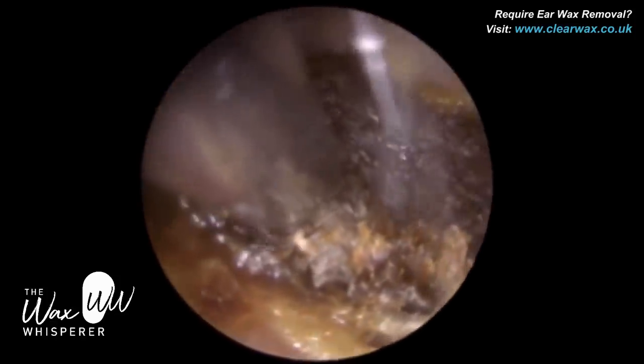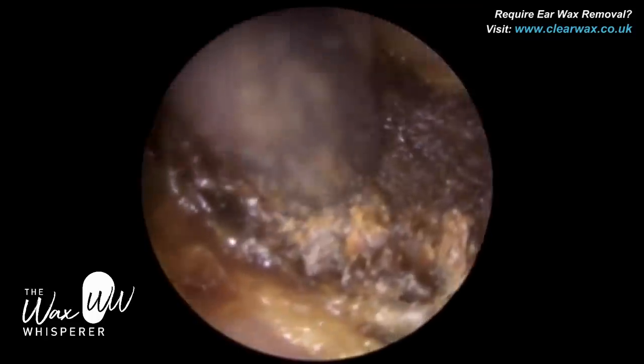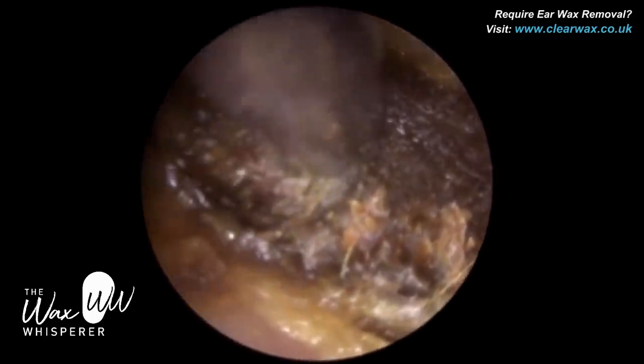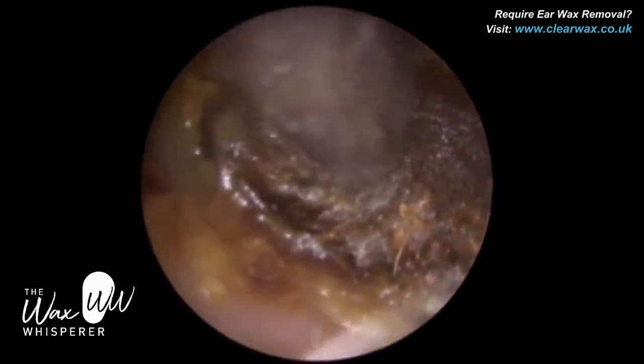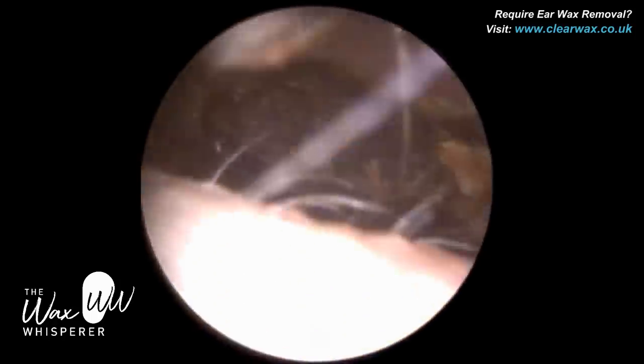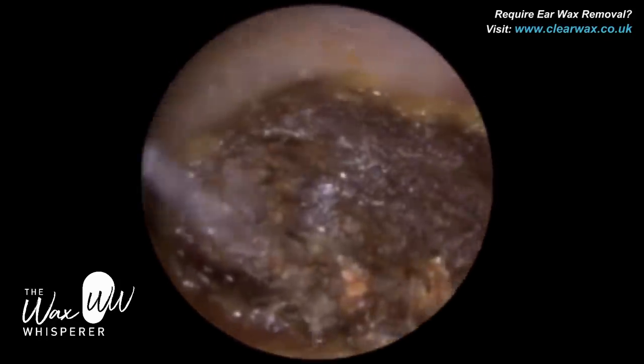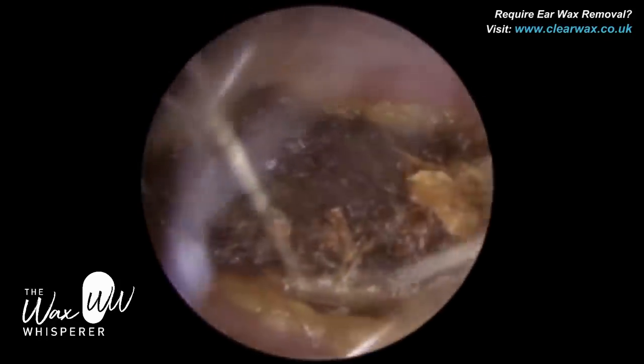In some ways it was a very tricky procedure, and you'll see that during the next eight minutes or so. The patient didn't do themselves any favors because they had used a cotton bud, which further impacted this wax very medially deep in the ear.